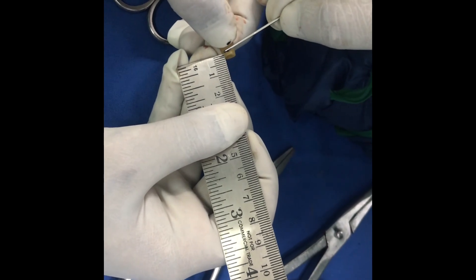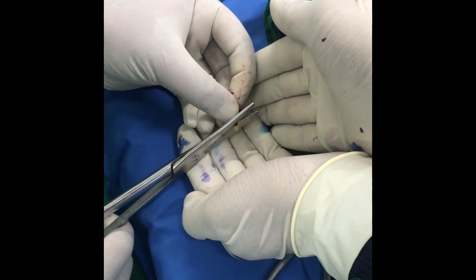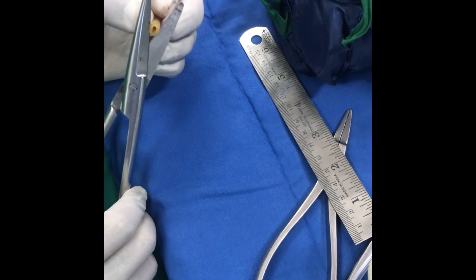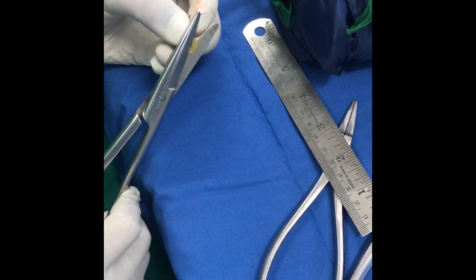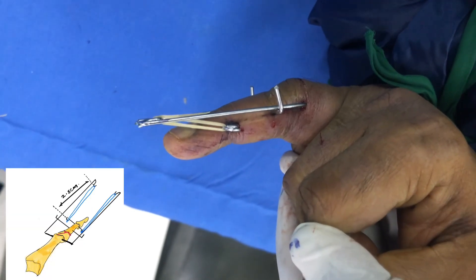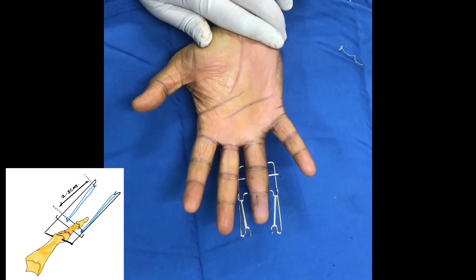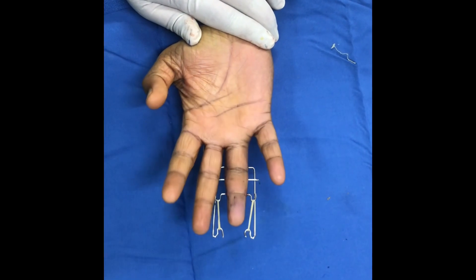IV set rubber band is used to make the rubber bands — this rubber is very sturdy and doesn't break usually. 1mm breadth strips of the rubber are cut, and they are also handed over to patients as spares. A rubber band is then connected across the hooks.